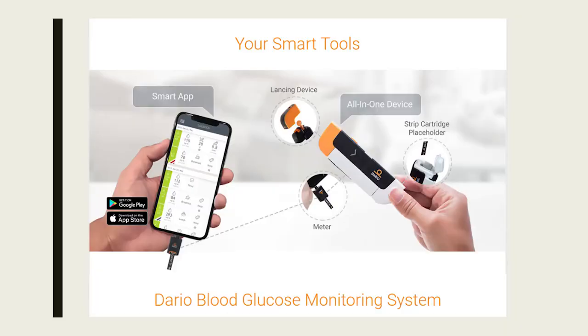Most of this talk is not about blood glucose meters. In fact, this is the only blood glucose meter that I will discuss. There are a lot of advances in blood glucose meter technology and in the software and applications that help people with diabetes. But this one I saw a patient use in clinic the other day, and I thought it was fascinating, so I started to look it up.